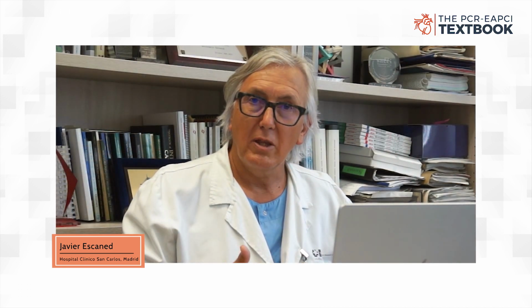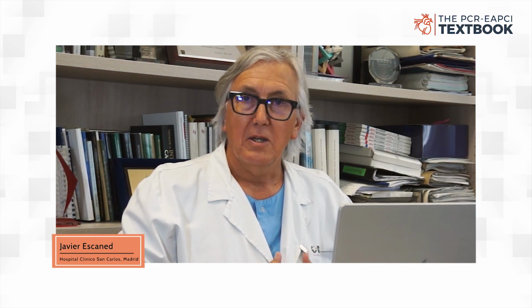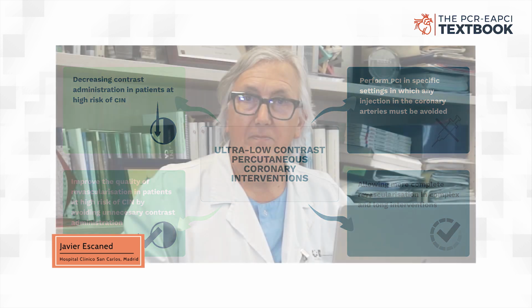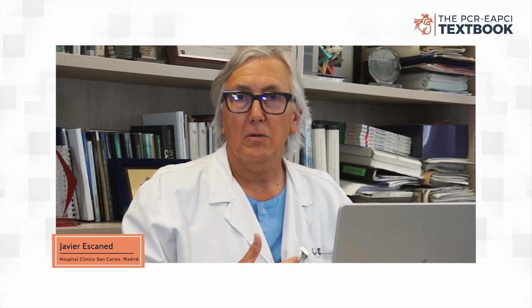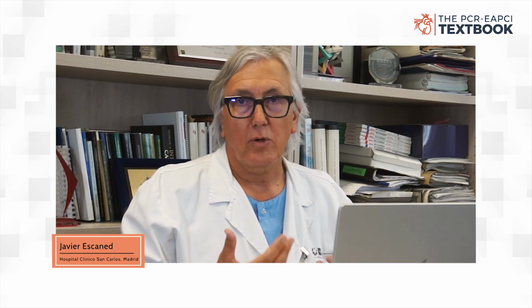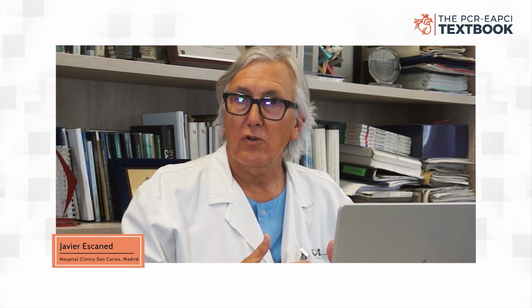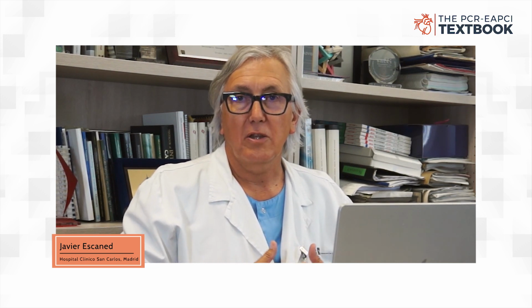The patients that we treat nowadays in the cath lab are patients that have multiple comorbidities and patients who, on many occasions, restriction of use of contrast may contribute to improve the safety of the intervention or even the quality of the intervention. I'm thinking not only of patients who have chronic kidney disease, but patients in whom, given the complexity of the case and a long procedure, liberal use of contrast may contribute to having to stage the intervention.